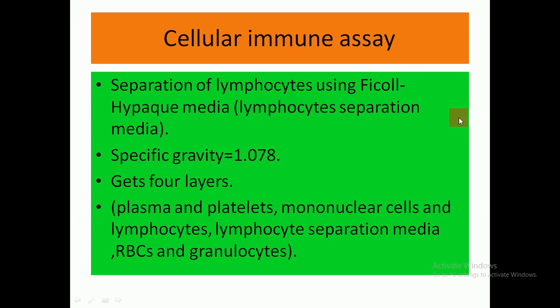Now we have a new subject, which is cellular immunoassay, to assess the cellular immunity and to detect the cellular status of the immune system. First, we must separate the lymphocytes. And here we use a medium called lymphocyte separation medium, or Ficoll-Hypaque medium.